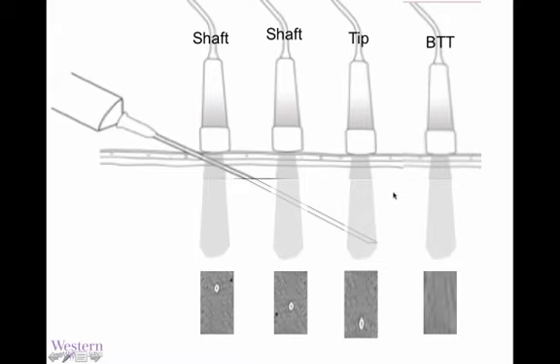The next step then is to advance your probe a little bit, either angling or physically sliding the probe down the neck of the patient just beyond the tip, and then advancing the needle into your field of view such that it appears on the screen.